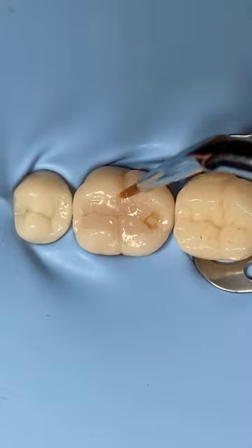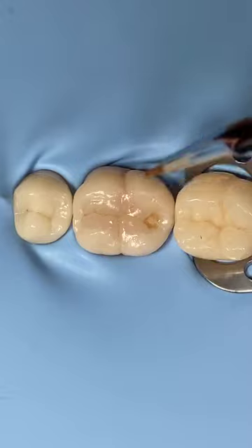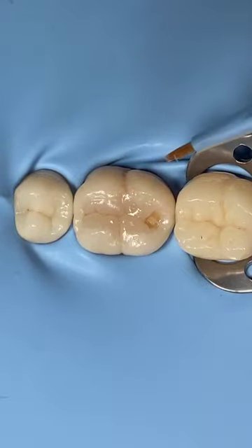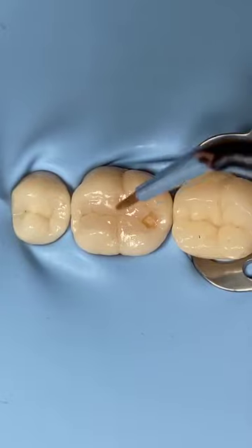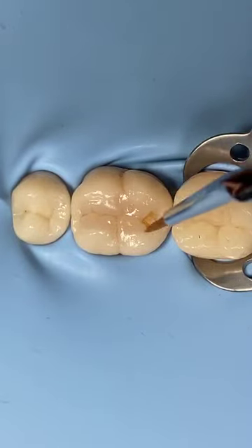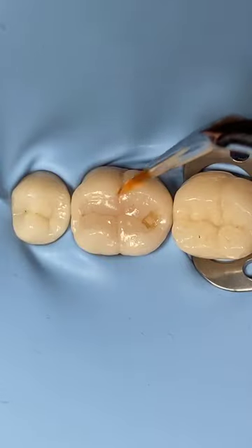If you see my Instagram post, you may wonder why there's no dust there. It's because I can polish all the surface, since I have a very flat, very smooth surface. That's why there is no dust trapped inside the fissures. So this step is very important.